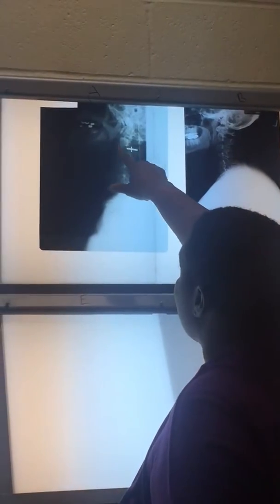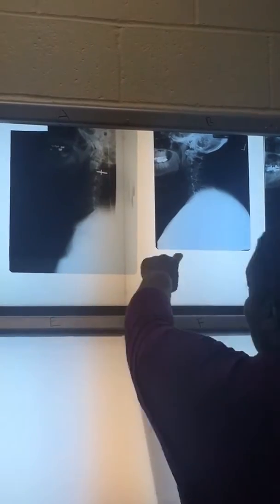And then you definitely are going to have an image with artifact on it. Be able to identify if it's an earring or necklace. You should be able to tell what it is on the x-ray, and its approximate location. Like if I was to locate this artifact, it's an earring located around C2. Or they've got teeth located in the mouth, or if it's a necklace, where the necklace is dropping. That type of thing. So those would be some things that you would have to do on the lateral.